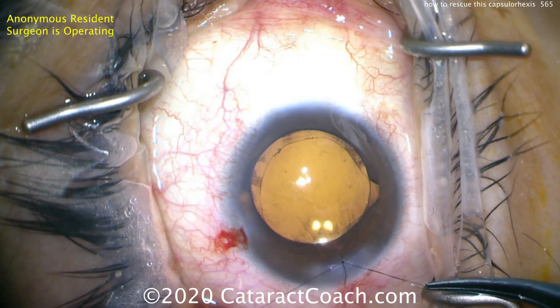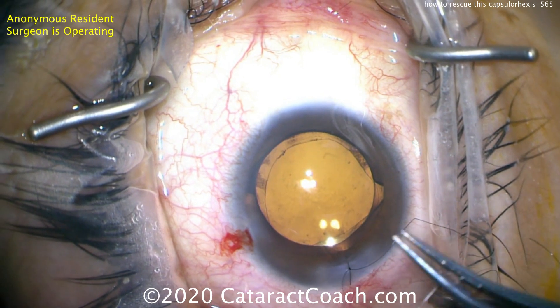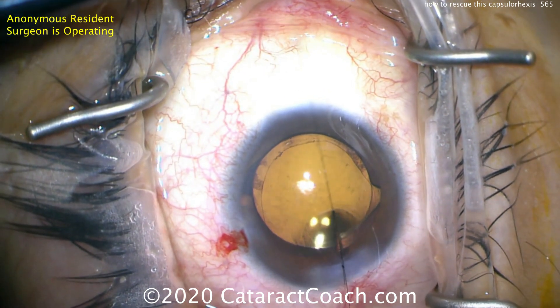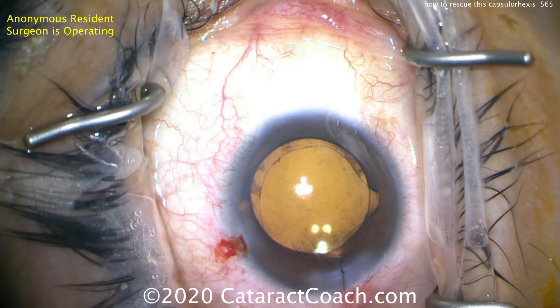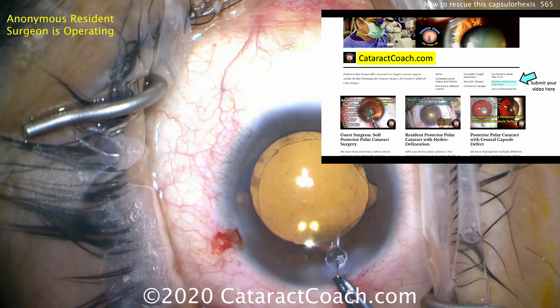The answer is failure to pivot — hitting the side of the incision, causing the anterior chamber to collapse a little bit, losing viscoelastic, and then using the wrong force vectors. Remember: if you want to have the perfect circle, the tips of your instrument should trace that capsulorrhexis circle, and the rhexis edge just follows.